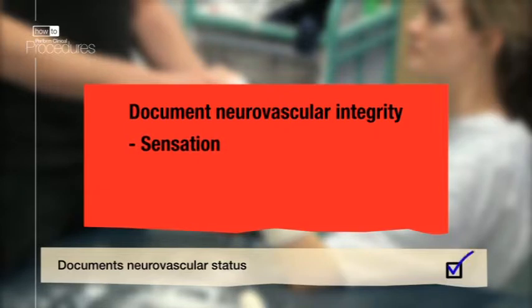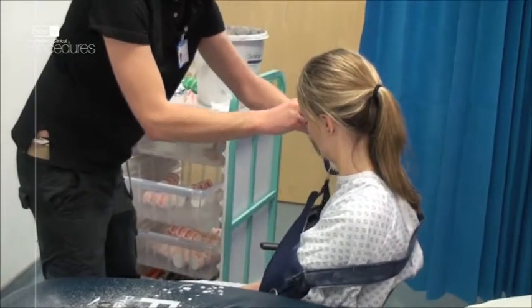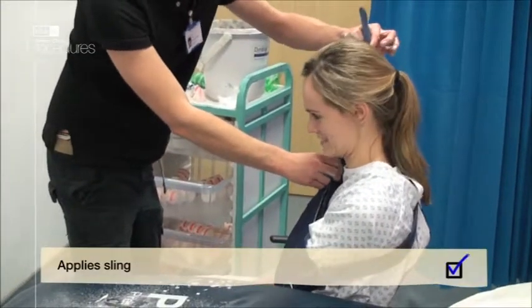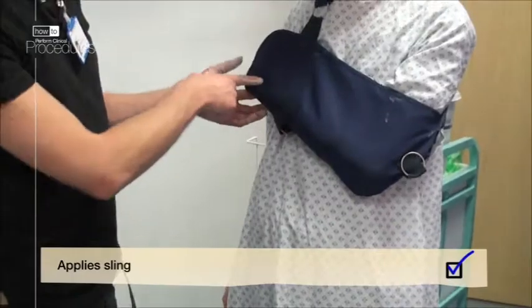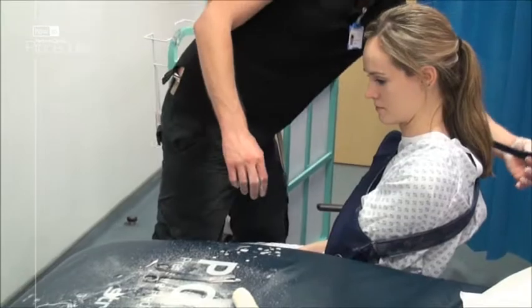Documentation should include sensation, movement, and capillary refill. Finally, pop the wrist into a high arm sling, which helps with any swelling — the hand should be higher than the elbow. Remember to book the patient into fracture clinic for a review, where decisions will be made regarding definitive treatment.